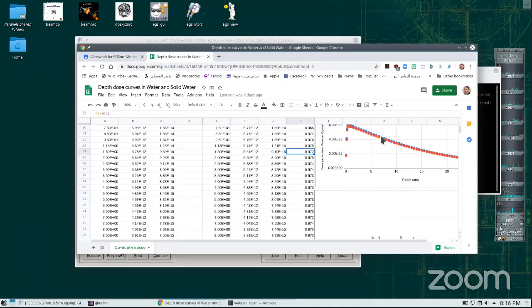There's a question before we go for this. Is the density of lungs the same for all, or does it vary by age? When we say density of lung, we know that if the patient inhales or exhales, it's different, right? Exactly. So here we're talking about some static density of lung. When I use lung density of 0.3, this is an average. It's not just by age, but even in the same person, it depends on the state, exhaling or inhaling, right?